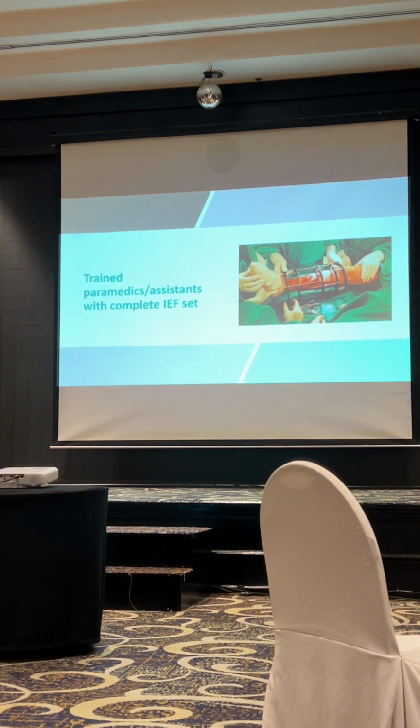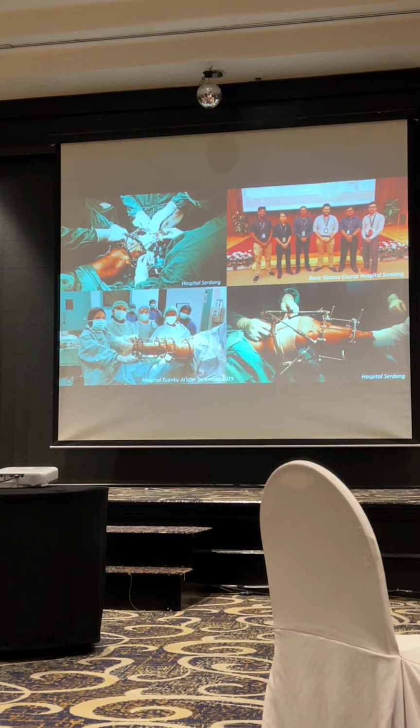So you have to have a team. If you are in a district setting, you have to train your team, and you have to have a complete Ilizarov set. Doing Ilizarov with poor or incomplete devices is very challenging. You have to train your paramedics and assistants to smoothen the procedure of doing Ilizarov. Like I mentioned, this is training and doing it again and again. Having a team which scrubs with you regularly helps a lot.